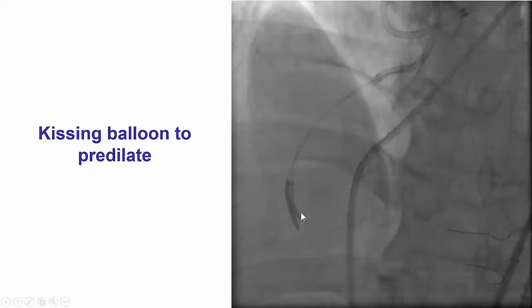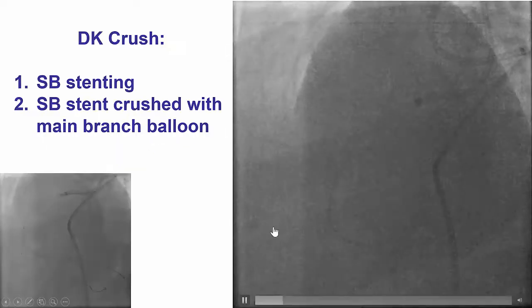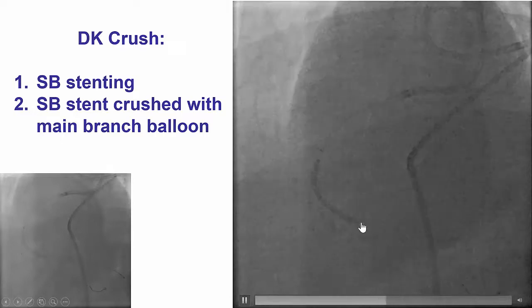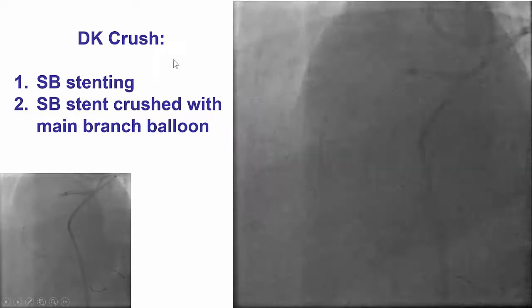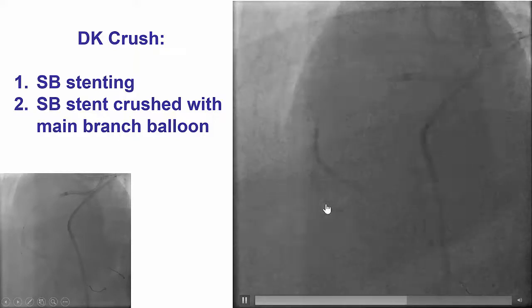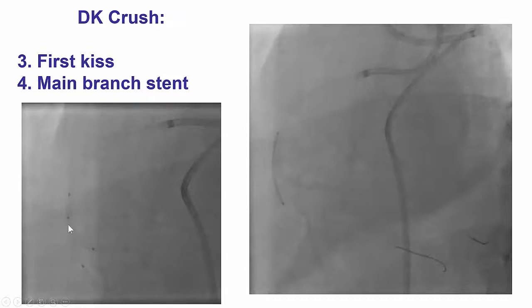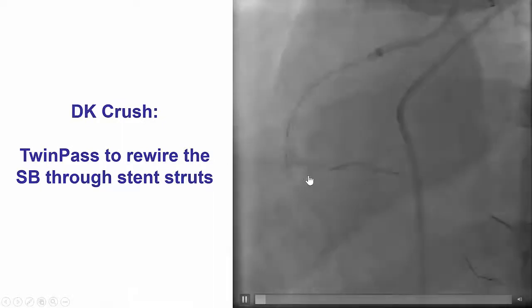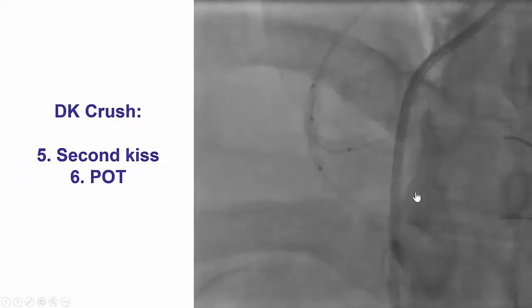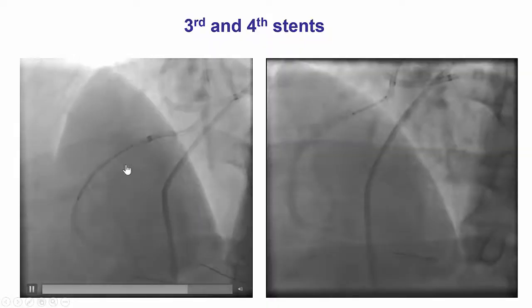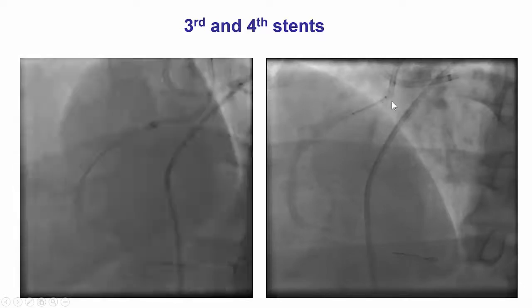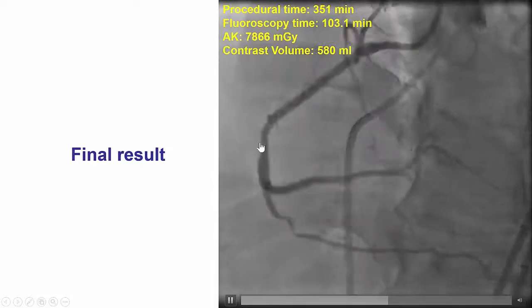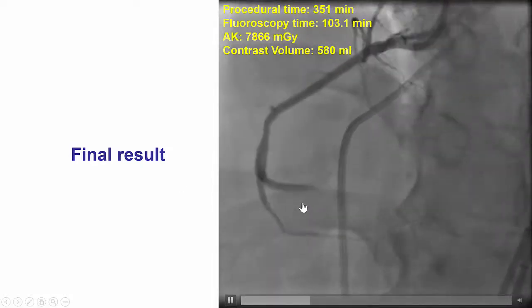Given that we had an important bifurcation with subintimal dissection on both sides, we decided to use an upfront two-stent strategy. We pre-dilated both branches, then deployed a stent into the posterolateral vessel using the DK crush technique, crushing the stent with a balloon in the main vessel. We then rewired and did the first KISS inflation, inserted a second stent into the PDA, deployed it, used the Twin Pass Torque microcatheter to wire back into the posterolateral, and then performed the KISS balloon inflation as well as proximal vessel optimization. We placed additional stents in the mid and proximal right coronary artery all the way to the ostium, and were finally able to achieve a nice result with TIMI flow in both the PDA and the right posterolateral.